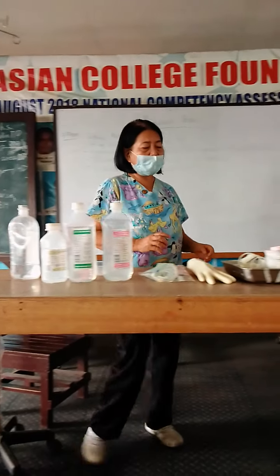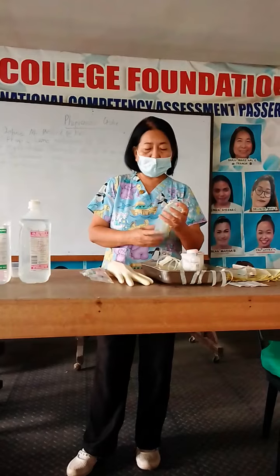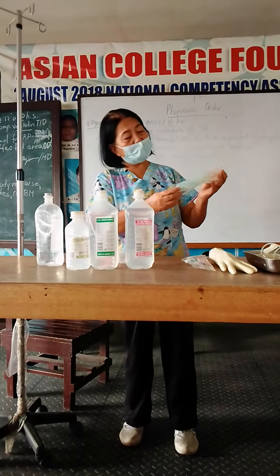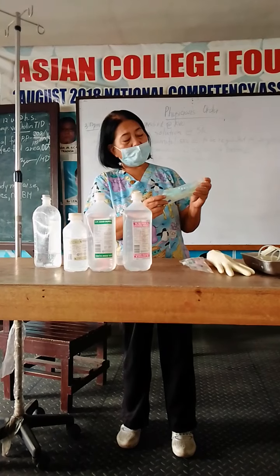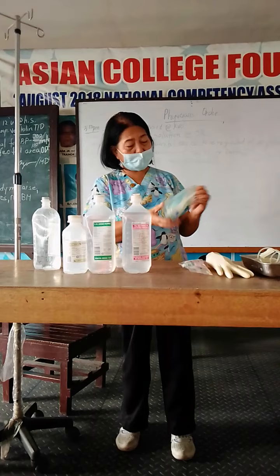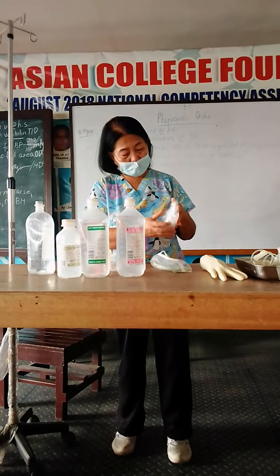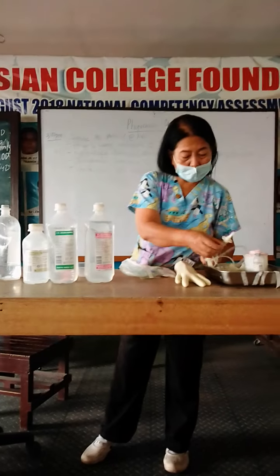In opening the sterile box, we need a Venoclysis, of course. We also check again the expiry date and the integrity of the packaging. Also, what is written here? Is it micro or macro? Okay, so it is the one we need. It is macro drip. This is micro. Okay, macro drip.